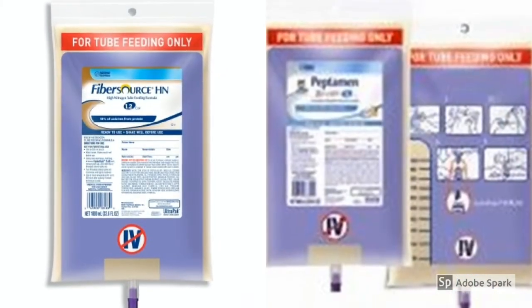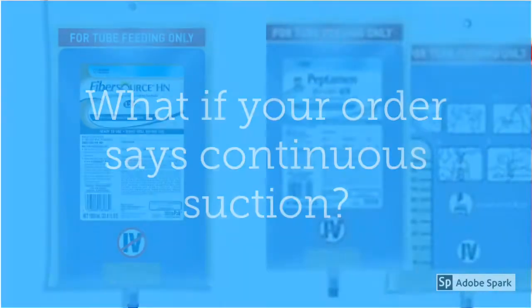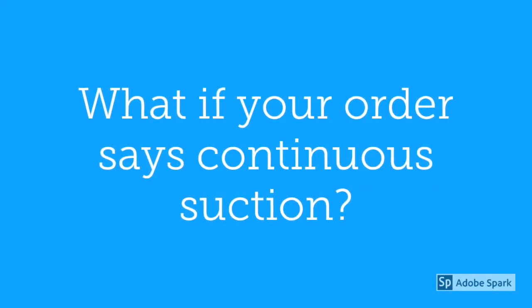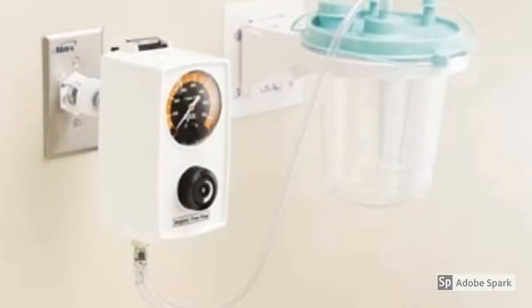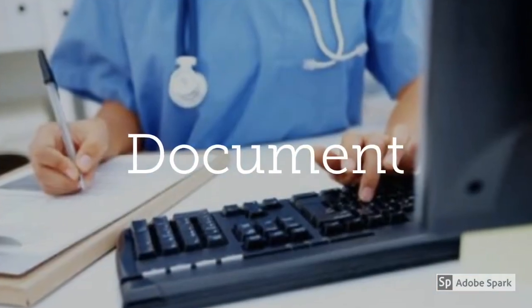Be sure to treat your tube feeding formula like medications. Each bag looks very similar, but each one is different, providing the necessary nutrition for individual patient needs. So what do you do if your order says continuous suction? Well, first, make sure you have wall suction, a suction canister, and suction tubing. You need to know how much suction the doctor has ordered and what the parameters are of how much is too much. Finally, we need to document.